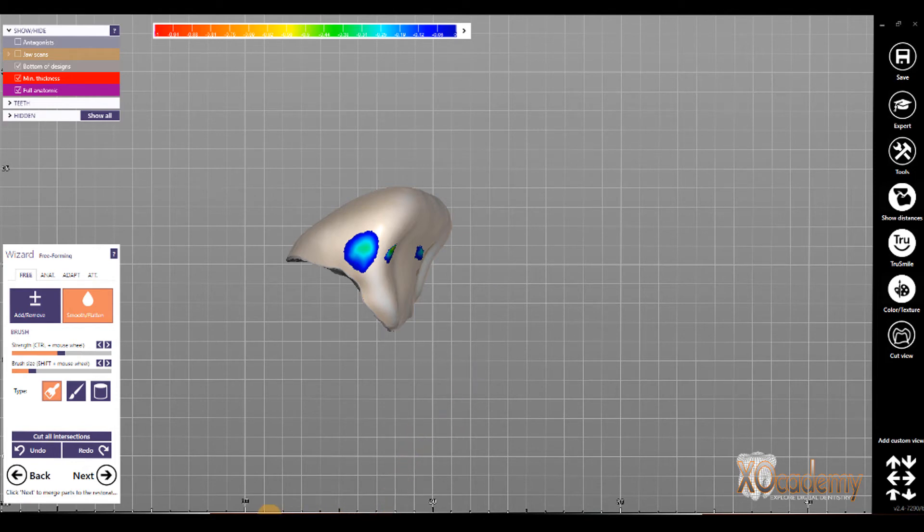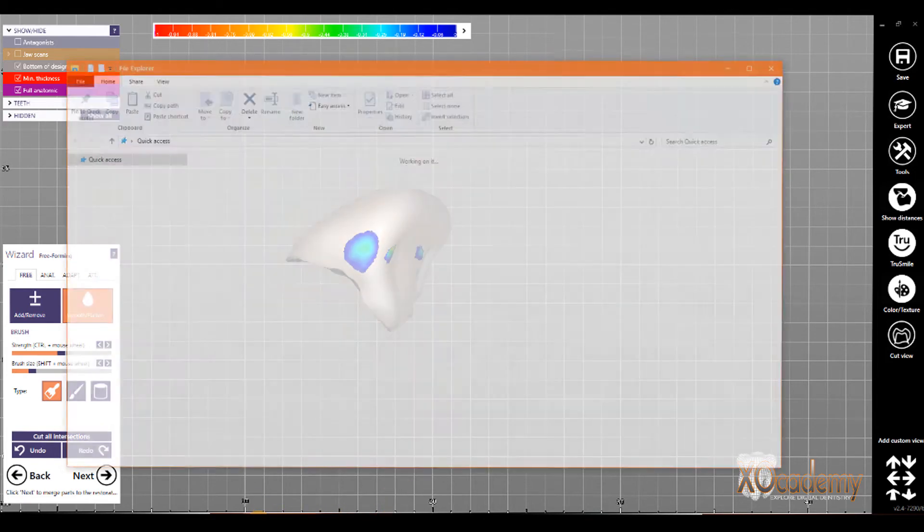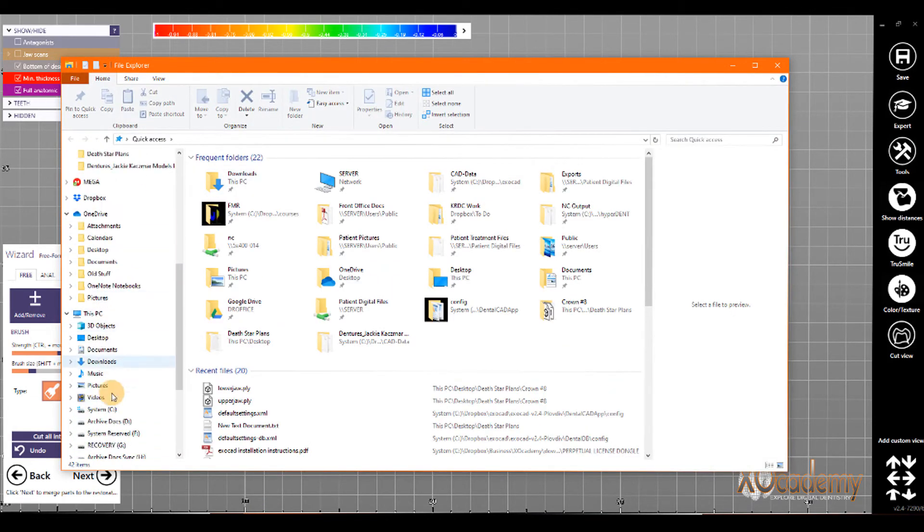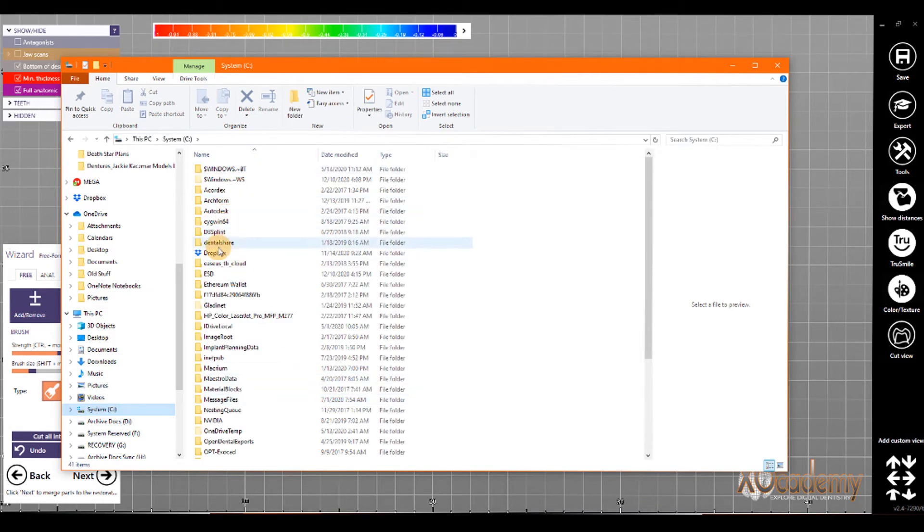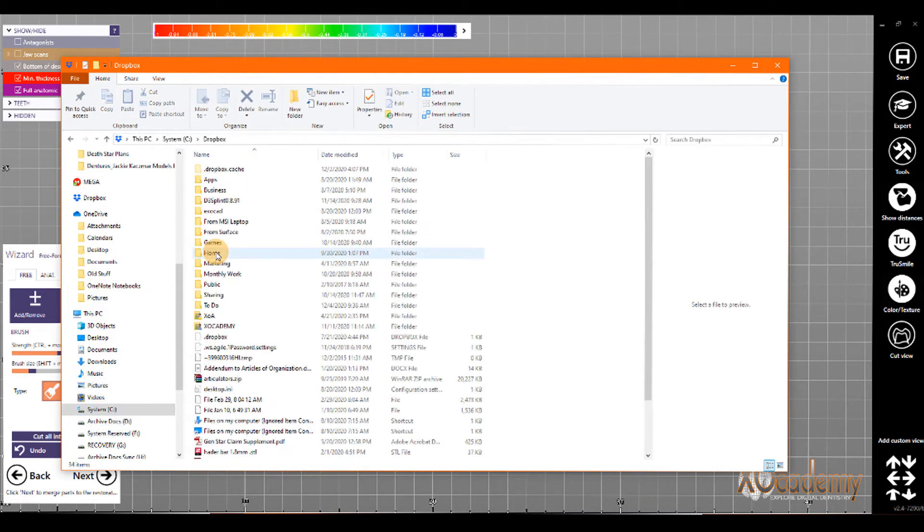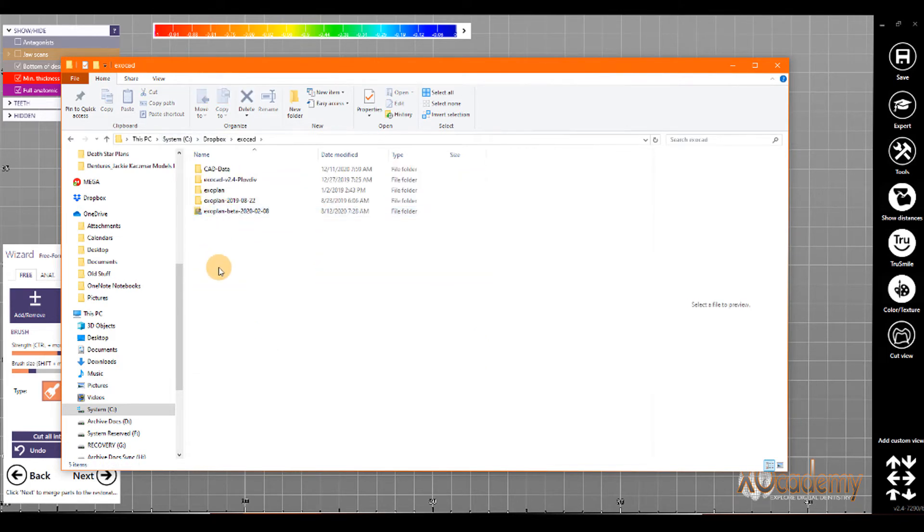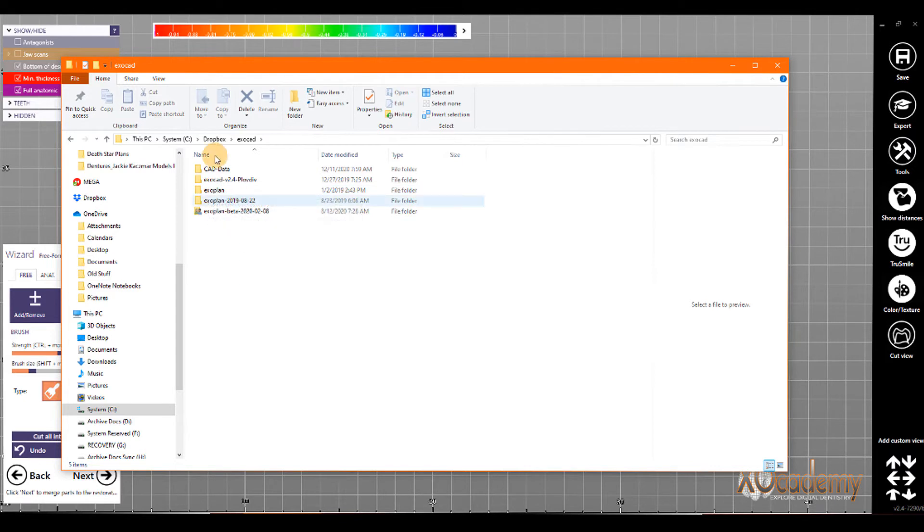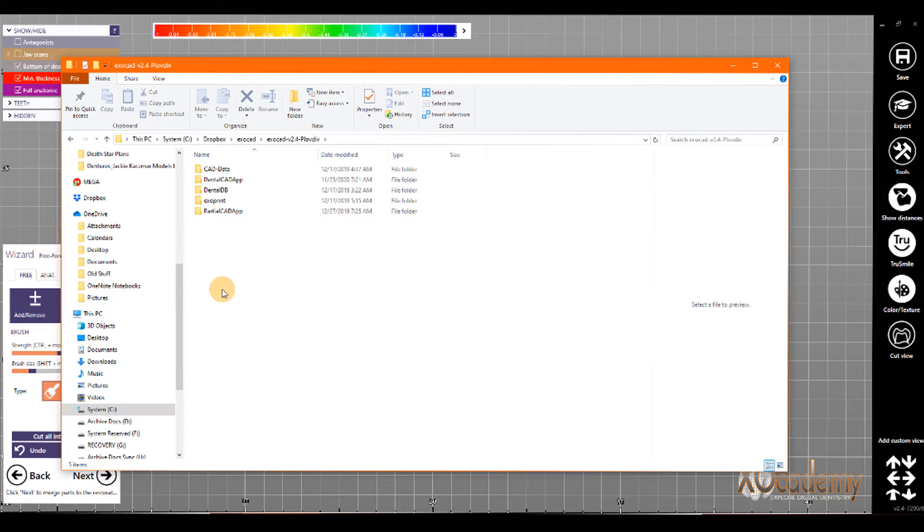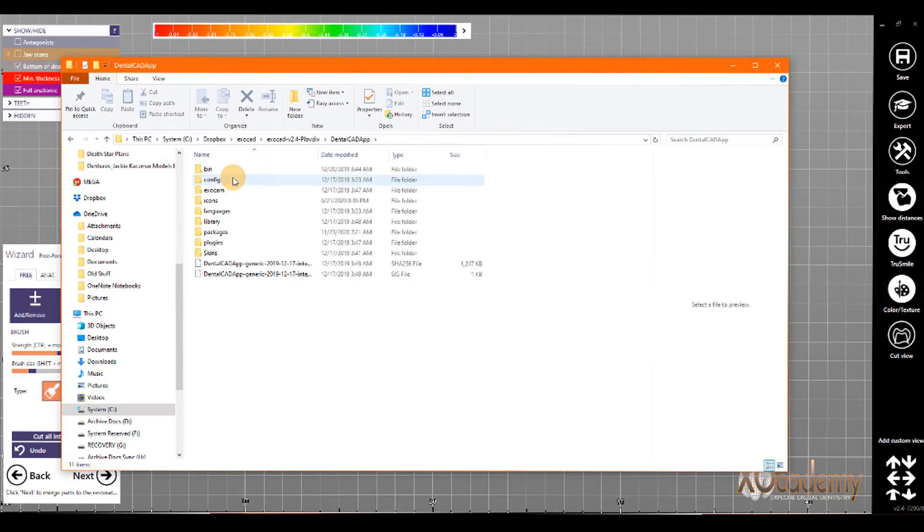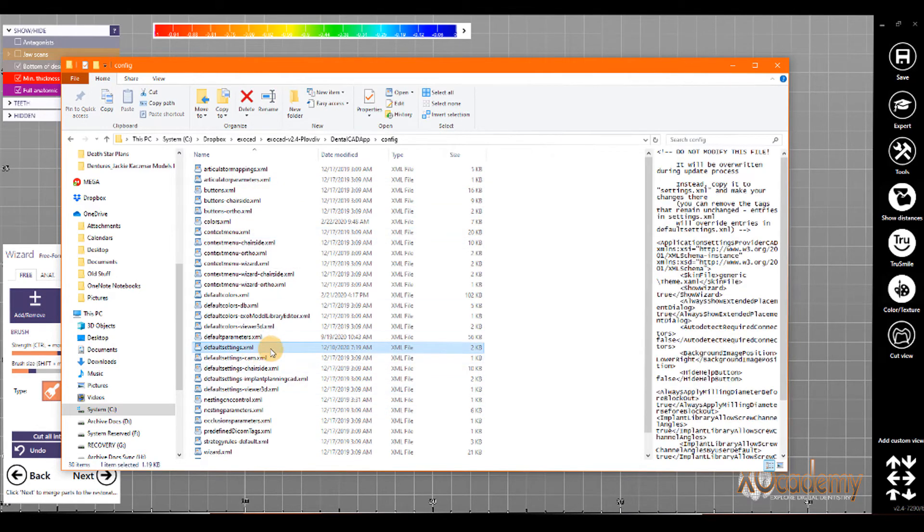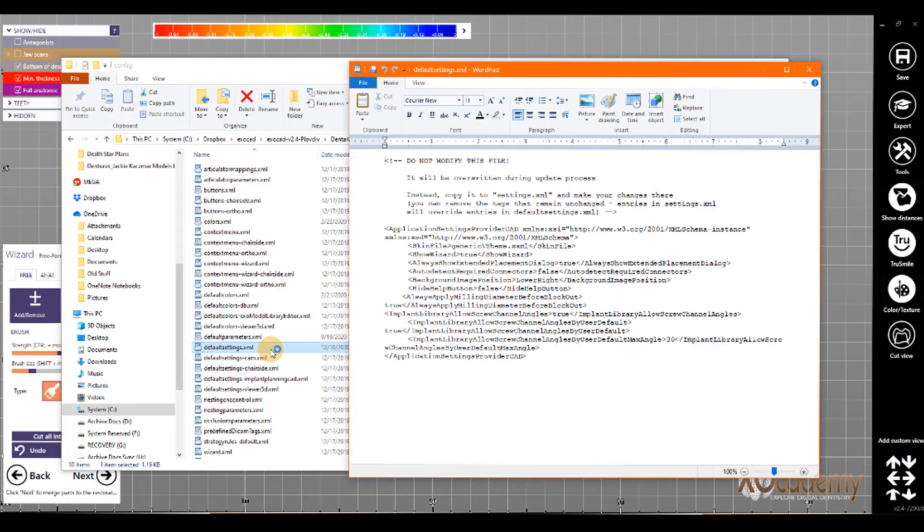And in order to change these, we need to go to our ExoCAD folder. So, mine is on my C drive here. I put Dropbox on the C drive, and then put ExoCAD there. And that way, all of my case data gets synced whenever I do something, across all of my workstations. And it also syncs the settings that we're about to change. So, if I'm at Workstation 1 right now, and I make these changes, that will update the XML file on all of my workstations because it's in my Dropbox folder. So, I go to DentalCAD app.